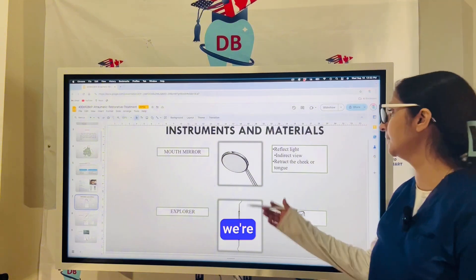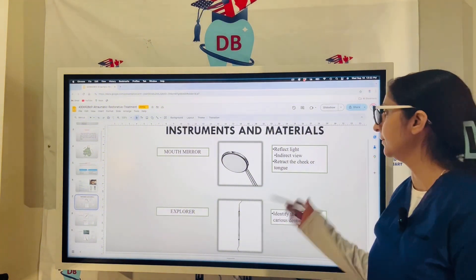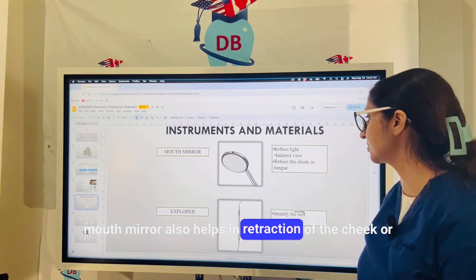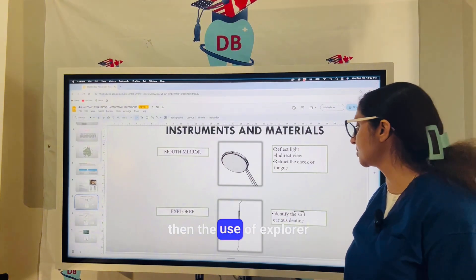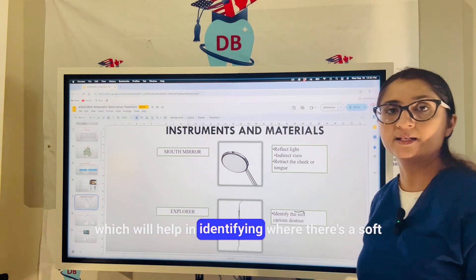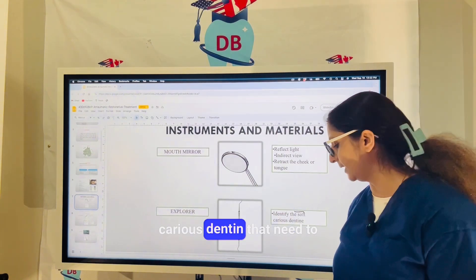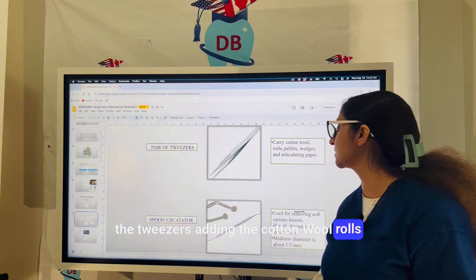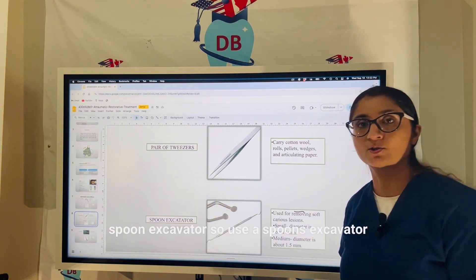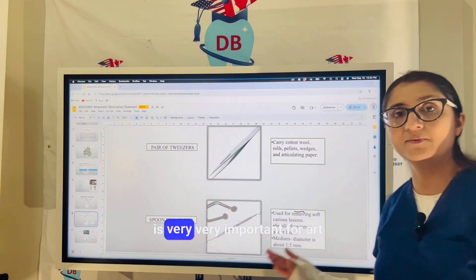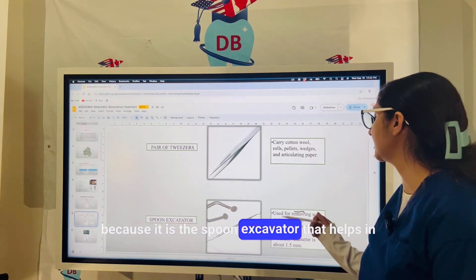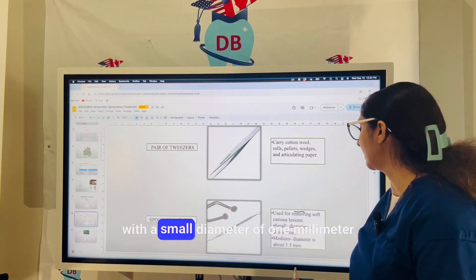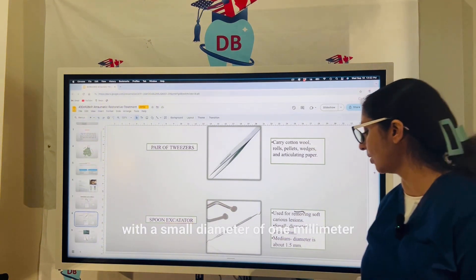The instruments used in ART begin with the mouth mirror, which reflects light, provides indirect vision, and helps with retraction of the cheek or tongue. The explorer helps identify soft carious dentine that needs to be scooped out. Tweezers, cotton wool rolls, and pellets are also used. The spoon excavator is very important for ART because it helps in removing the soft carious lesion, with a small diameter of 1 mm or medium diameter of 1.5 mm.